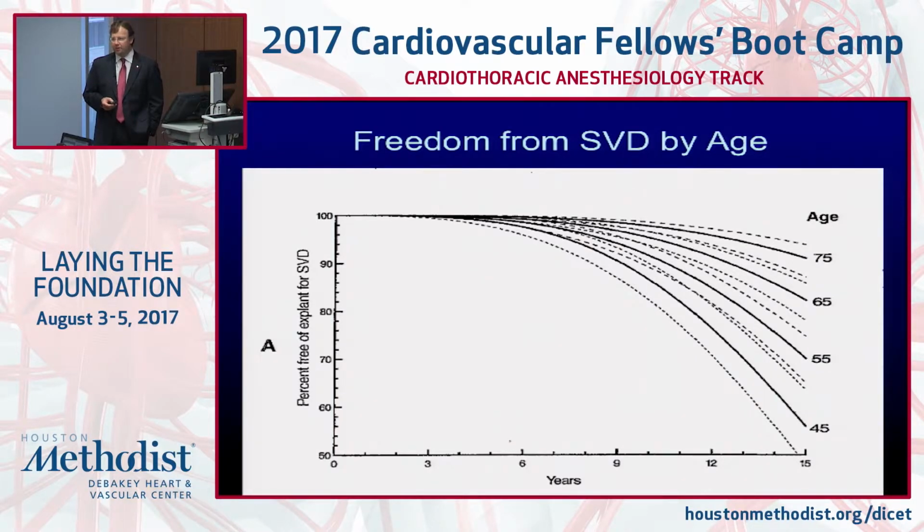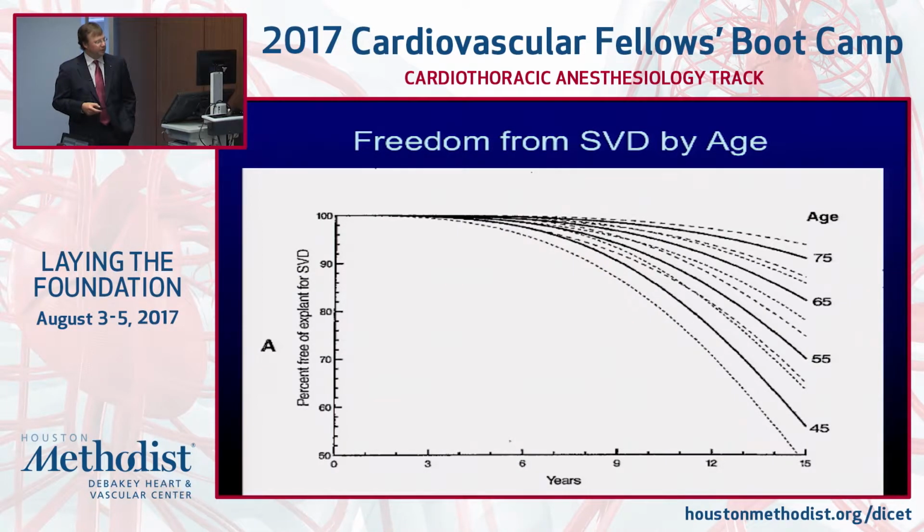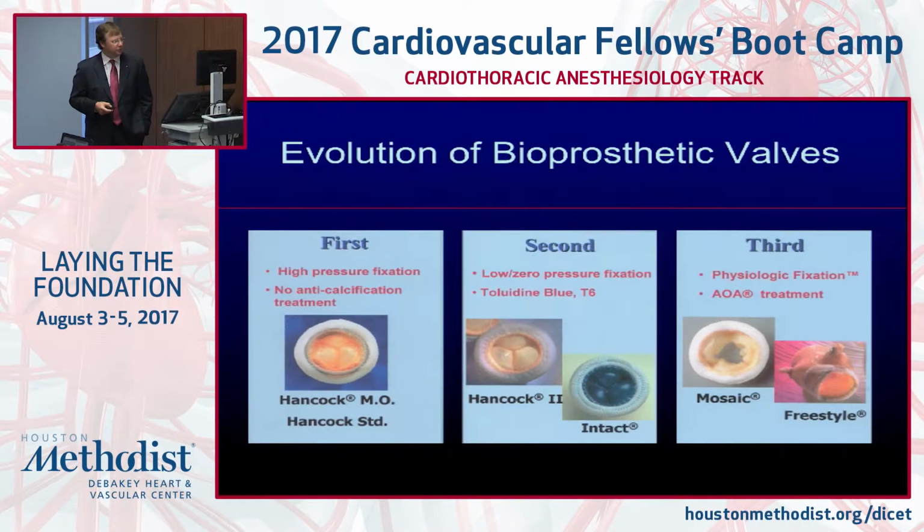But there are also biological mechanisms, and Jameson and some other people found out relatively early on that there was a discrepancy in the age at which your tissue valves failed. So if you're 75 or older when you get your valve, typically you can last 10 or 15 years with that valve with about a 90% freedom from failure rate. The aortic valve fails less often than the mitral valve. Mitral valve bioprosthetic will fail more quickly, and I've got some follow-up figures that show that.